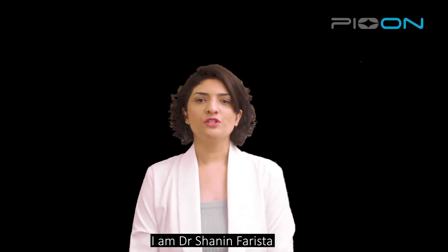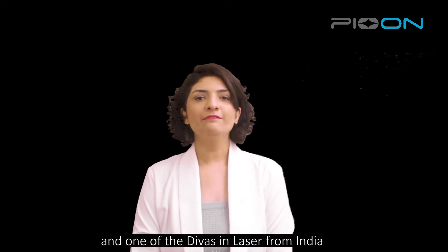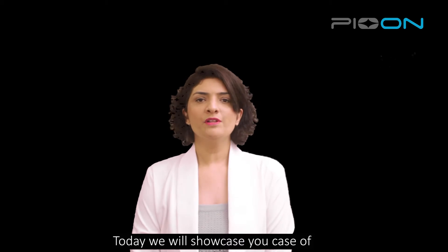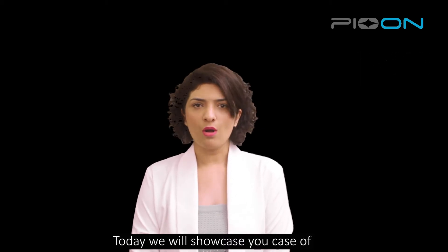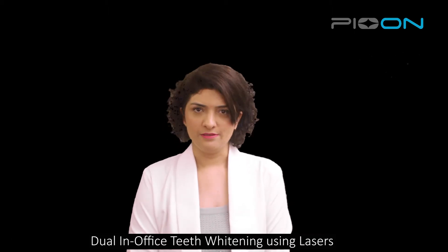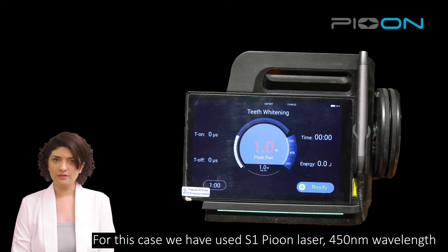Hello everyone, I'm Dr. Shannon Farishta, an endodontist and laser specialist and one of the divas in lasers from India. Today, we will showcase you a case of dual in-office teeth whitening using lasers. For this case, we have used S1 peon laser and 450 nanometer wavelength.